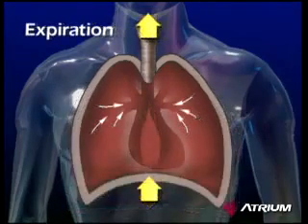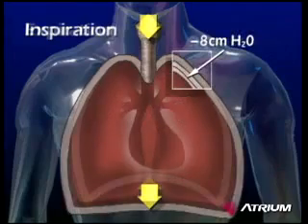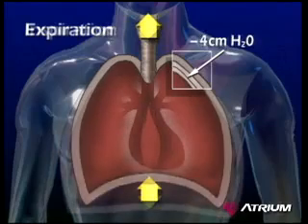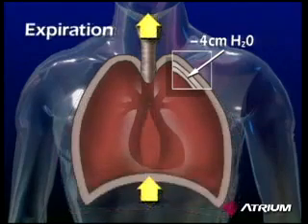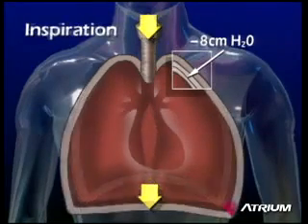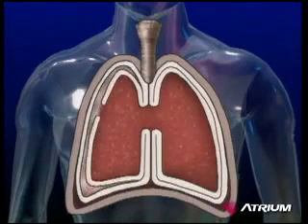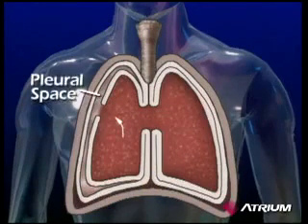Under normal conditions, there is always negative pressure in the pleural cavity. The degree of negativity, however, changes during respiration. When air, fluid, or blood enters the space between these 2 membranes, the space created is known as a pleural space. This is an abnormal occurrence and results in labored breathing.